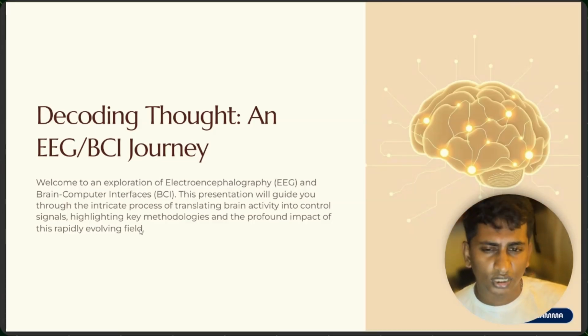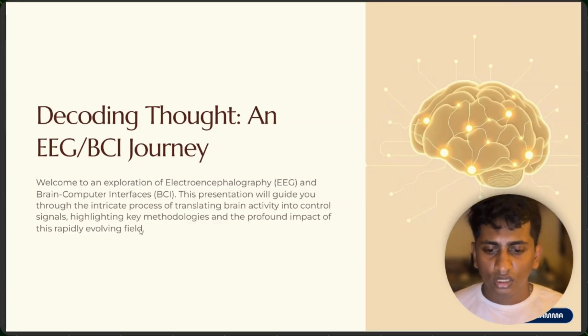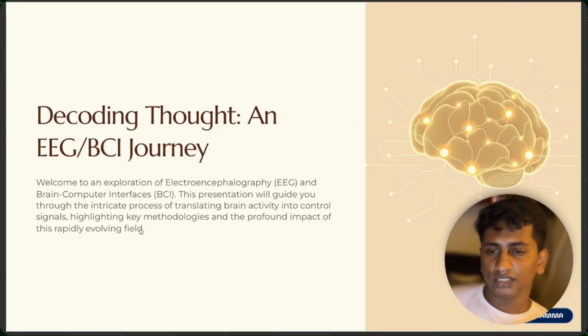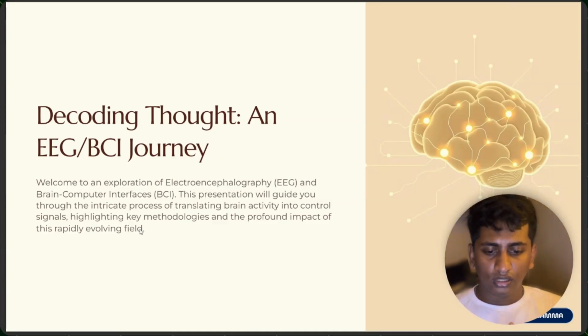Okay, so let's talk about this and give a summary. We cleaned the data, we used filters and ICA, and we had clean scalp images. Spectrogram ERSP images reveal the mu and beta ERD and ERS. CSP produces discriminative spatial mapping.